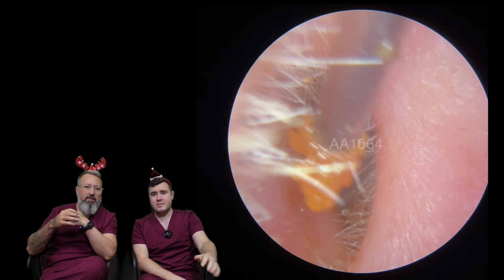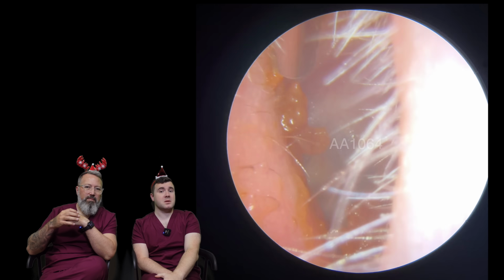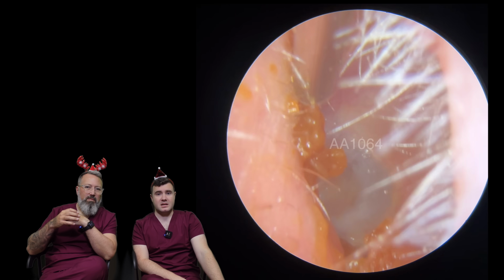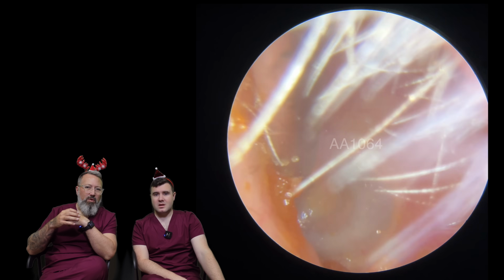Yes. So yeah, we've already cleared the biggest, most troublesome piece of wax there. We're just tidying up these last little bits. We've got quite dense hair in here as well, which seems to be going quite deep into the ear.